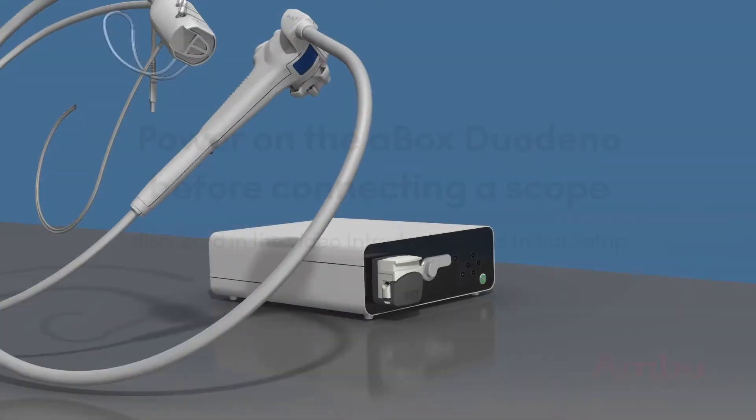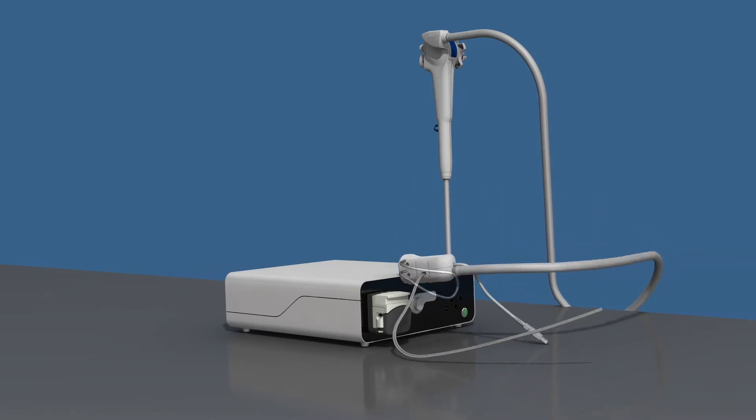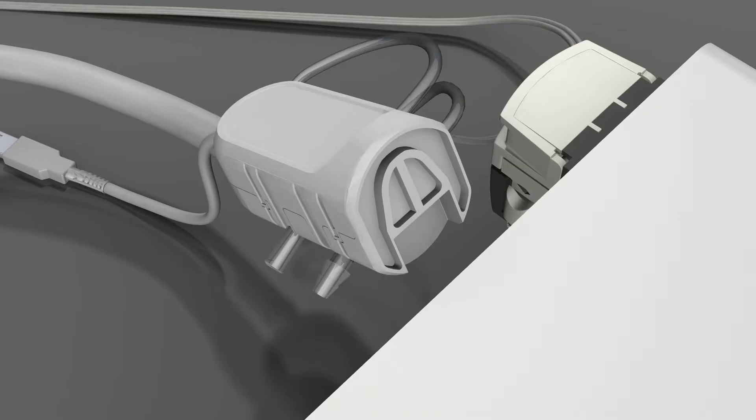Connect the A-Scope Duodino to the A-Box Duodino by securing the strain relief portion of the scope on the support bracket, located in the center of the front panel. This is a physical connection only.